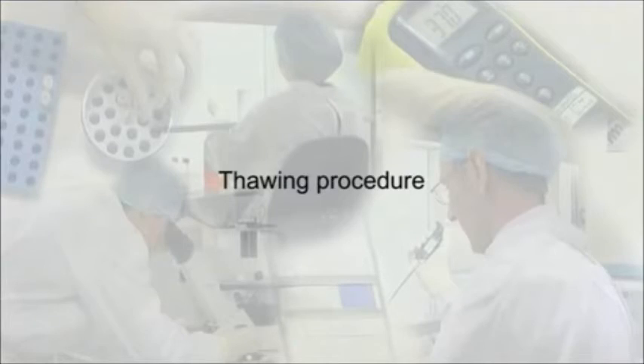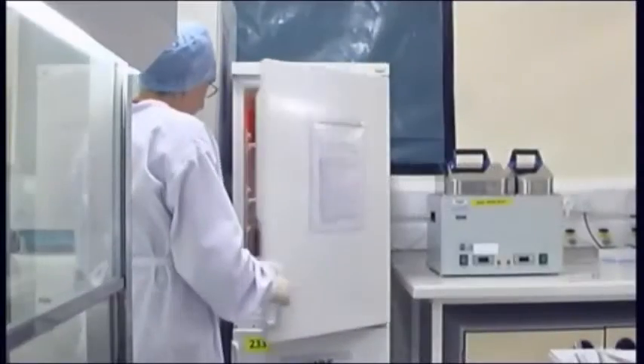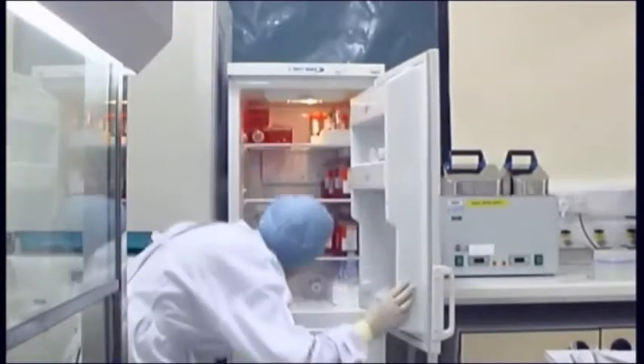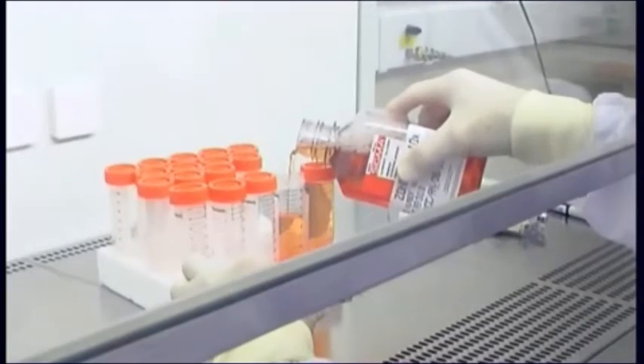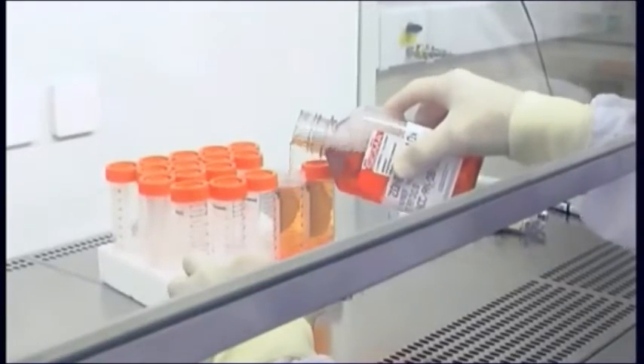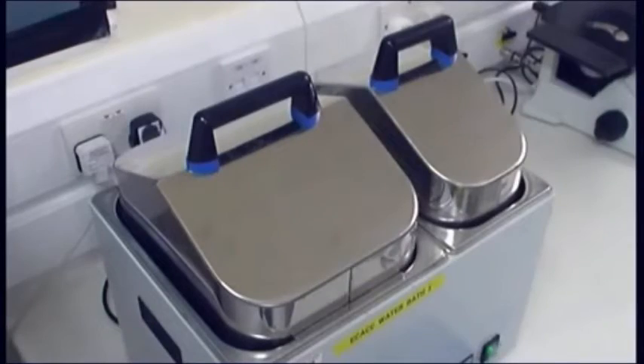Remember, work quickly but safely. Check the cell line data sheets and ensure you have the correct medium ready. Aliquot medium into usable volumes to prevent repeated heating and cooling and to minimize contamination risks. Warm the medium in the water bath.